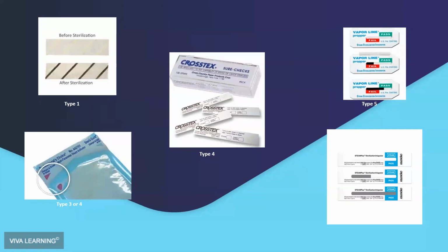Is it imperative to use cold sterile solution for plastics that can't go in the autoclave, or is a spray sufficient? Cold sterile is no longer referred to as cold sterile. It is called a high-level disinfectant, and it is an immersion product that actually is capable of sterilizing.